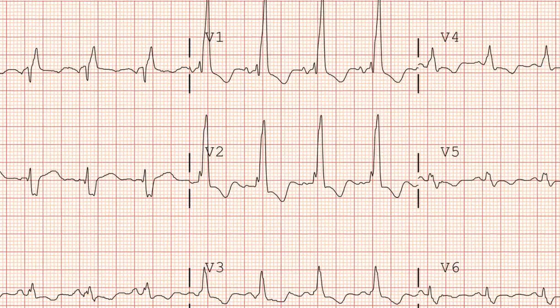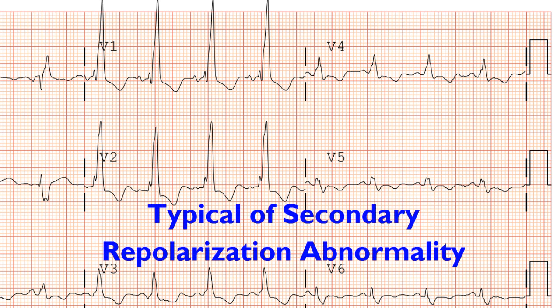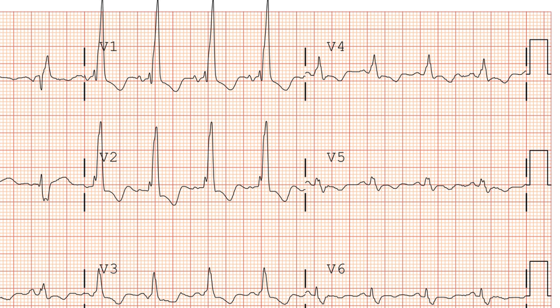Now let's look at the precordial leads. The ST segment and T wave changes are expected — the QRS is oriented anteriorly and is very positive in the right precordial leads, so it makes sense that this is where you see the most negative ST segments and T waves. We can't rule out something like acute MI or acute pulmonary embolism with this EKG, but we can say with confidence that the ST segment and T wave changes are typical of a secondary repolarization from a bundle branch block.